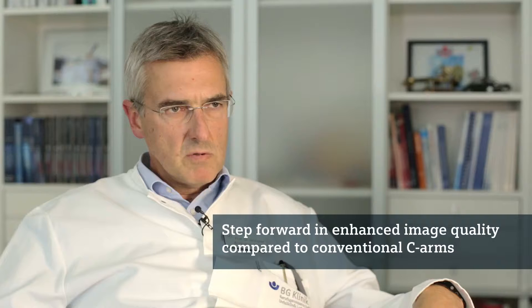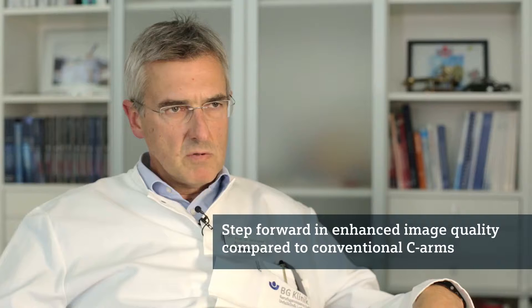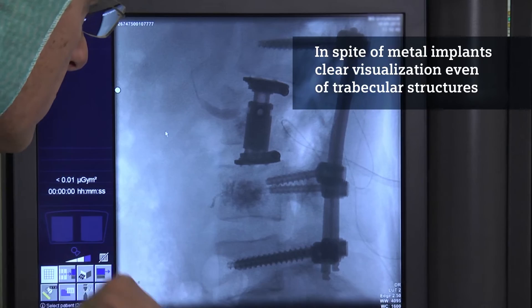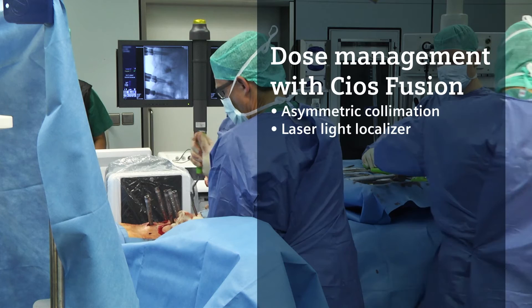This is a lack in the conventional C-Arms and a real step forward to an enhanced image quality. Amazingly, in spite of having a lot of metal inside, you still see the bony structures very nicely. Even the trabecular structures can be seen on that image.